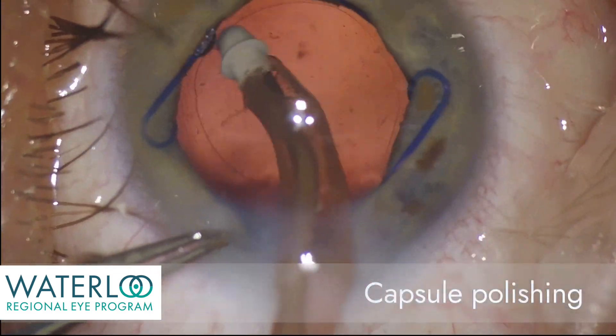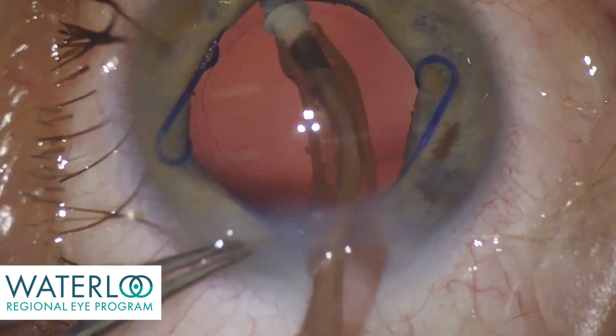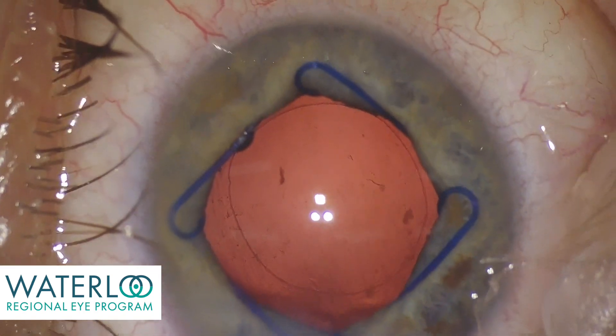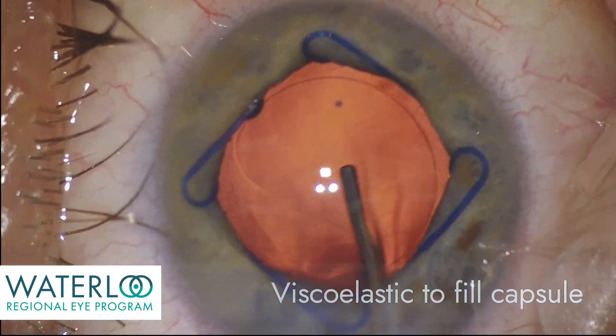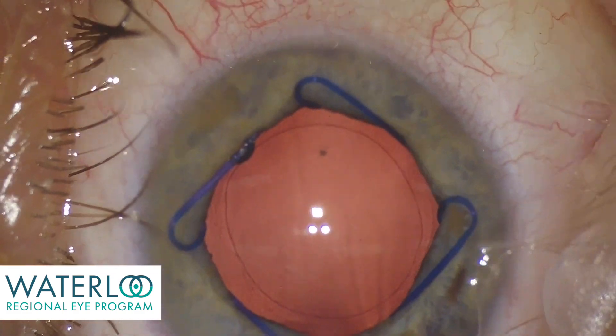The silicone tip of the handpiece can now be used to polish the capsule. The capsule is then filled with viscoelastic, the gel-like material that maintains eye pressure.